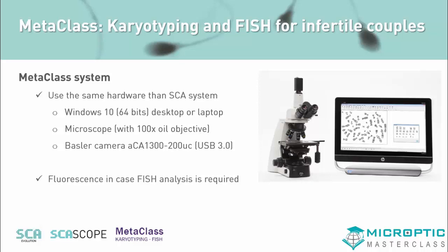And also, if you want the FISH option, then it's necessary to have fluorescence. So you have to buy the fluorescence with the different filters and attach it to the microscope.